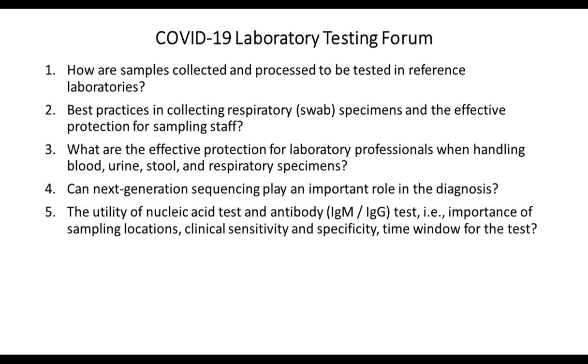Although it takes a little bit longer time and costs much more than real-time PCR, and more importantly, it has less sensitivity than the real-time PCR. So in practice, I think when we know the sequence of the genome and we have the specific target, which is the new coronavirus, I don't think we need to use NGS routinely for detection. Real-time PCR is quicker and more specific, and costs much less. So it's the best way to choose.